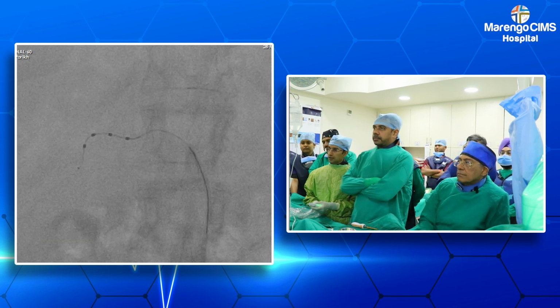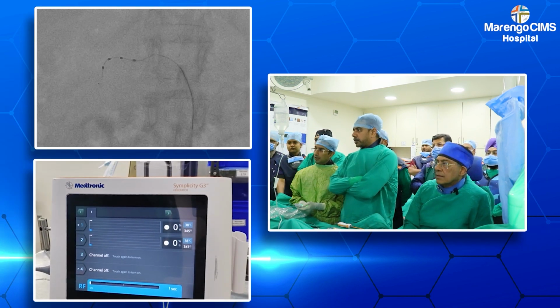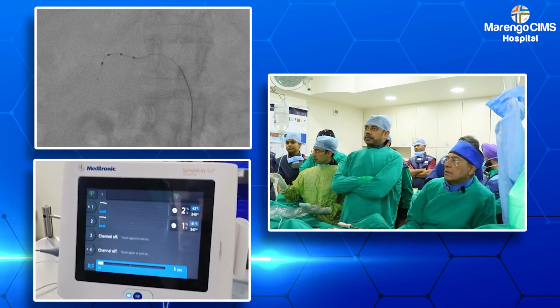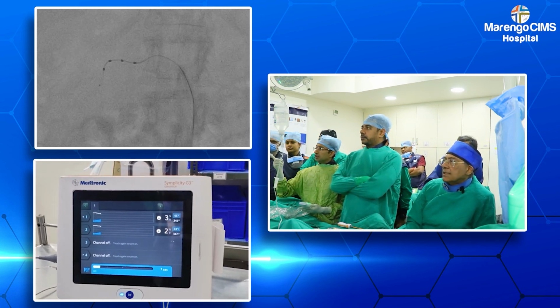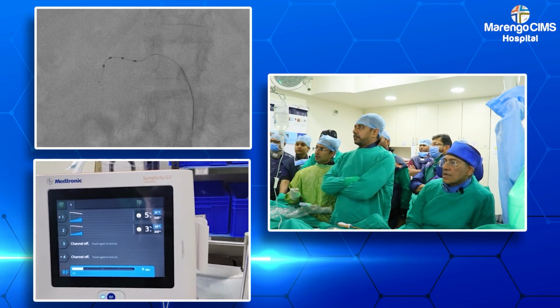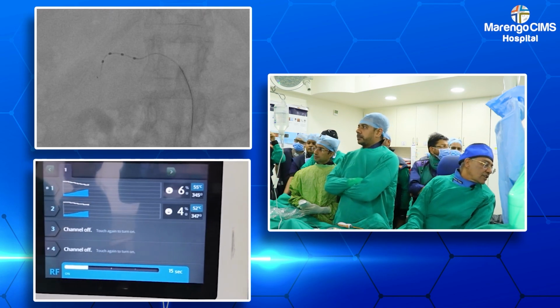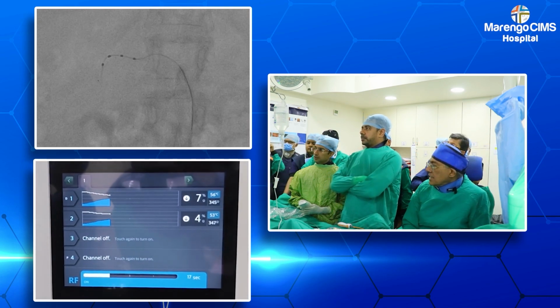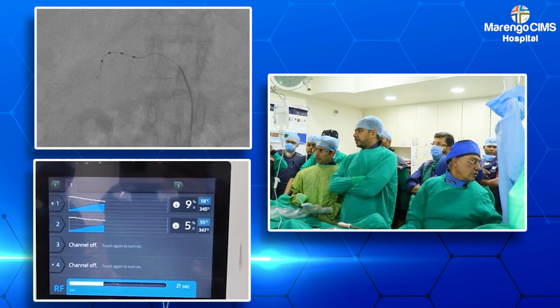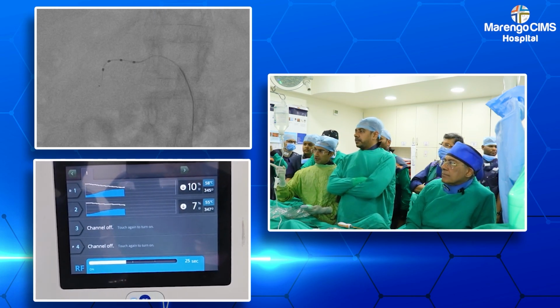Okay, so now I'm starting the ablation by pressing the RF button. As you can see on the monitor, the RF is now being delivered. You can see the temperature and you can see the resistance as well. The patient is reasonably sedated and she is very comfortable. The timer is already showing up on the screen. So roughly about 25 seconds are done.